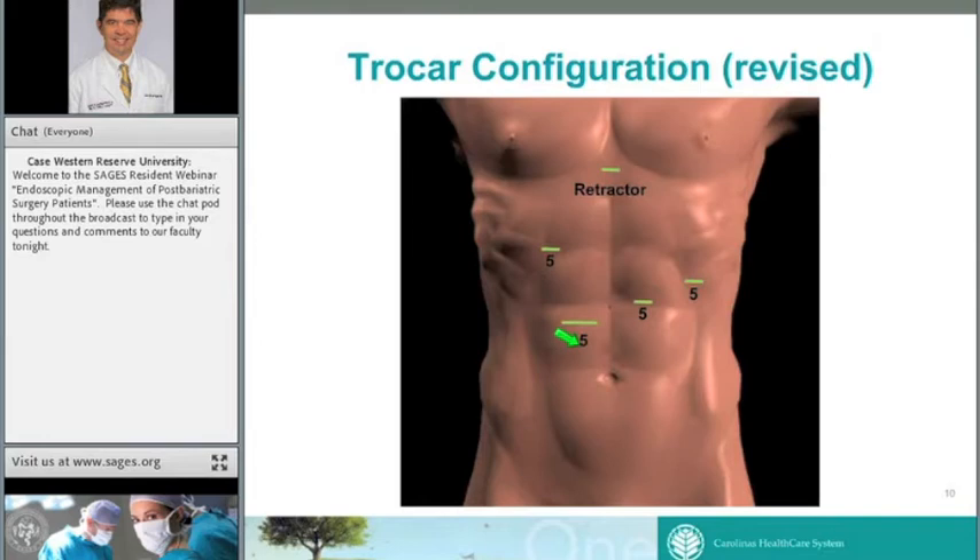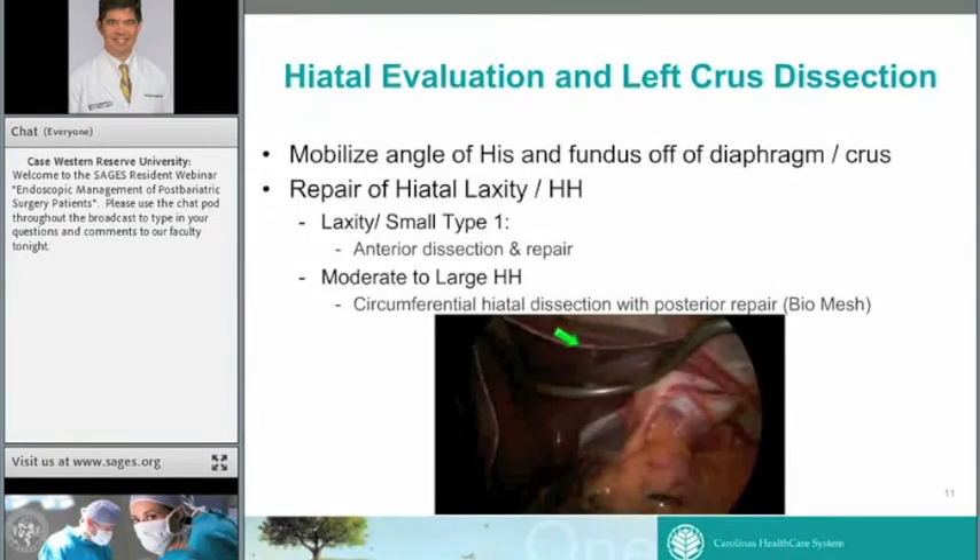By going to a 5-millimeter scope with improved optics, it also cuts down on pain. On initial view with the Nathanson liver retractor in, we look at the hiatus. This is an example of a small type 1 hiatal hernia with dimpling at the hiatus. Data from both band and sleeve indicate that any laxity or small hiatal hernia should be repaired. For a small defect like this, I'll dissect out the anterior half of the hiatus, reduce the sac, mobilize the esophagus, and place a figure-of-eight permanent suture anteriorly.